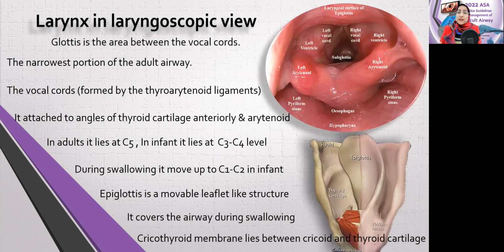Here we will see the larynx in a laryngoscopic view. When we do direct laryngoscopy and when we intubate our patient, we see this view. When we do direct laryngoscopy, we will see the larynx like this.